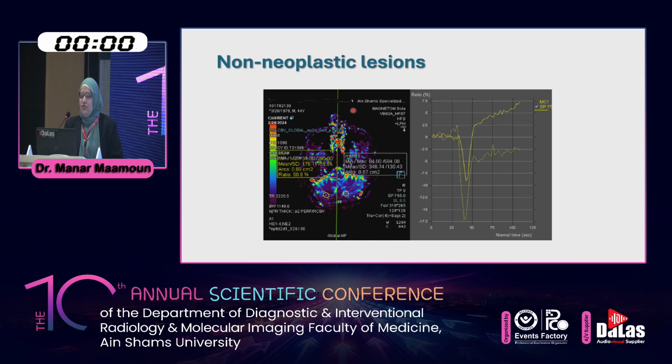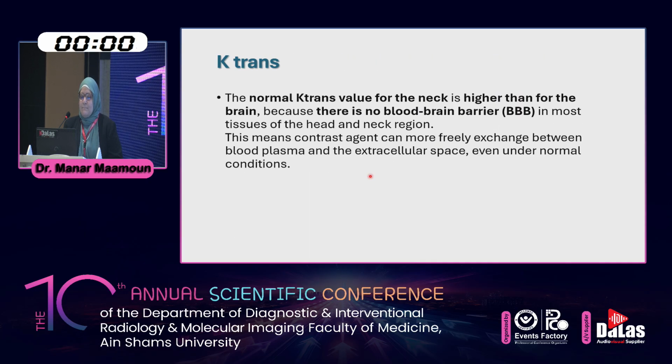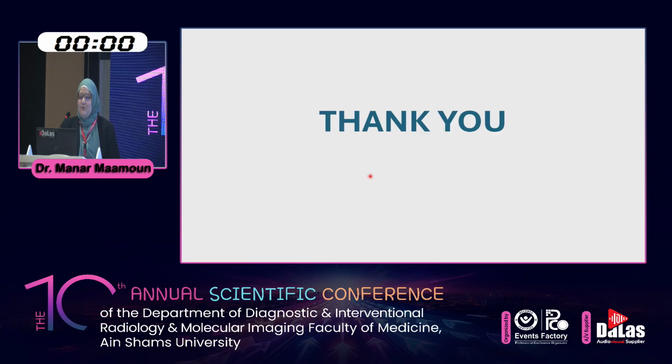A non-neoplastic lesion can show us a low relative cerebral blood volume. Okay, so there are normal values for K-trans, not approved 100%, but they can provide us a guide to interpret this technique. Thank you.